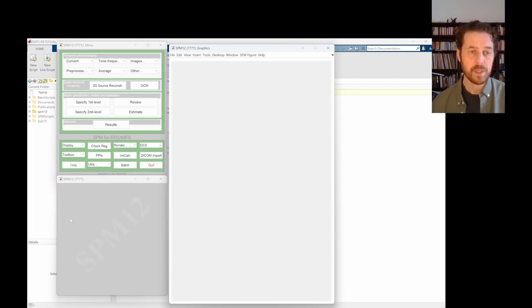And you'll get prompts appearing in this window that you can then alter these settings. This panel is also used to indicate the progress. So when a process is running, a progress bar will appear here, and we can just see SPM is ticking along nicely and how far away we are from completion.